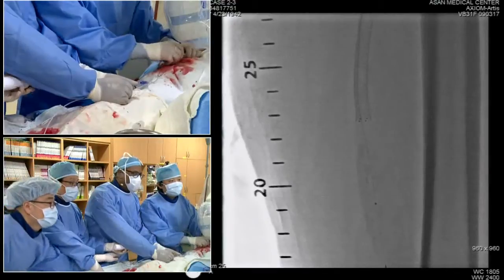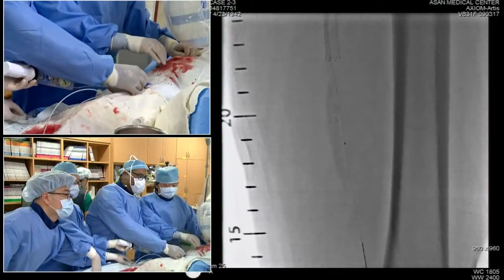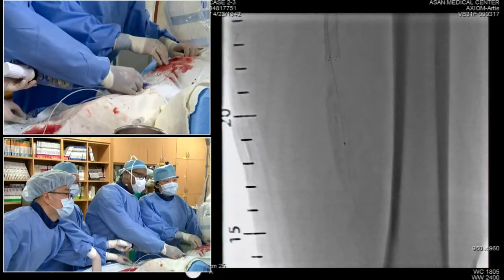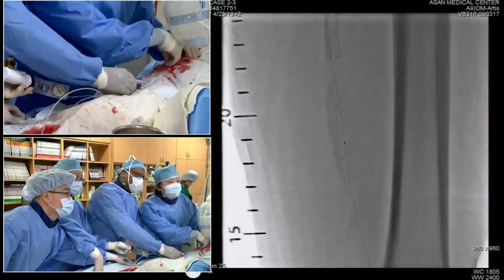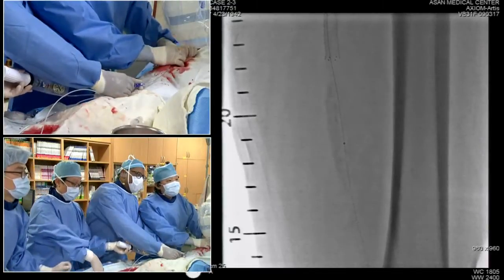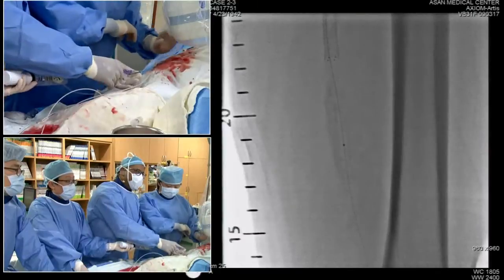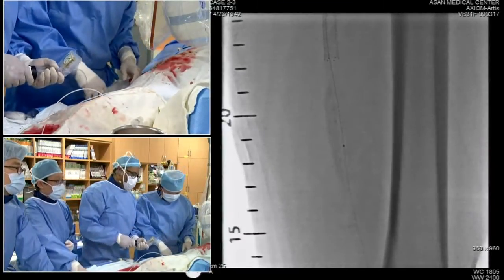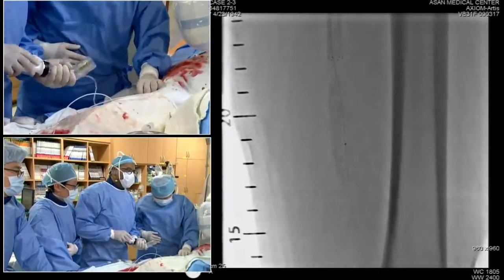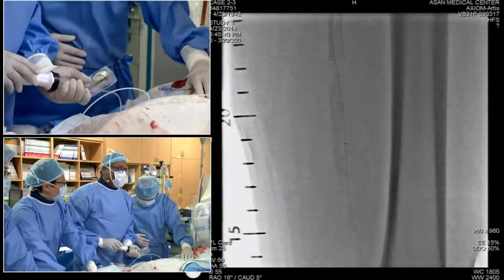Okay. Where do you think you re-entered? That's the key, because we have to go into that point. This is a 10-centimeter balloon, so I would keep on pushing. There's nothing to be lost by dilating into the lumen. What we don't want to do is wing out this balloon and then try to push it forward. You want to try to put it here? You think this is where you re-entered? You don't want to go a little further down? I personally would, but that's your choice.